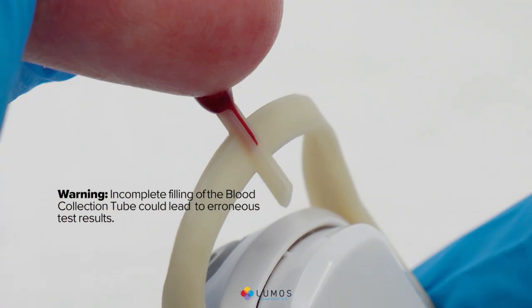Warning: incomplete filling of the blood collection tube could lead to erroneous test results. If the tube is not full, stop, discard, and retest.